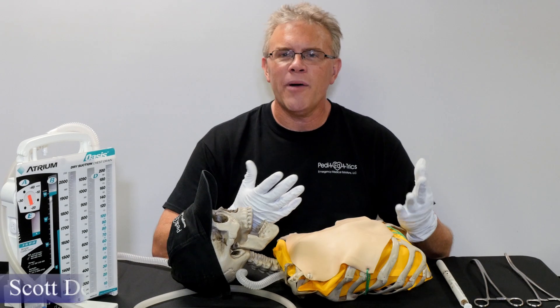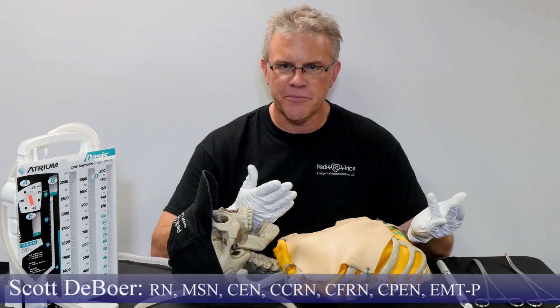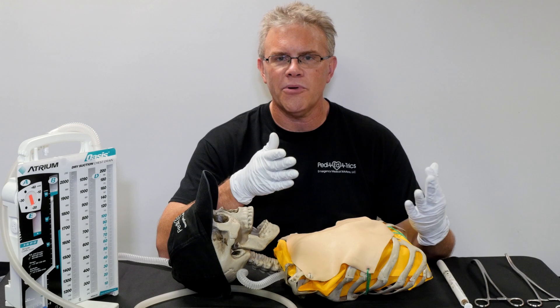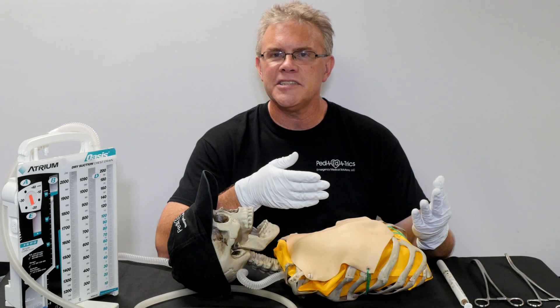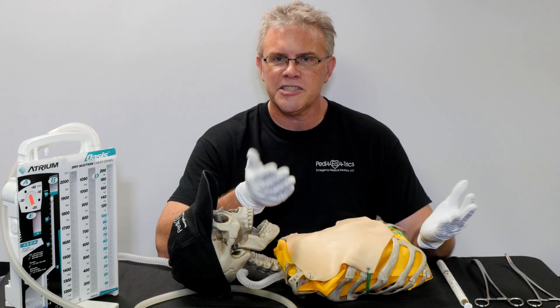Hey, it's Scott. I want to go ahead and just quickly touch on a couple things when it comes to chest tubes. Because most importantly, when you put a chest tube in a kid, remember, it's exactly the same chest tube that you put in an adult, just a smaller size. And as a rule, it's exactly the same technique as you use for an adult, just a smaller kid.